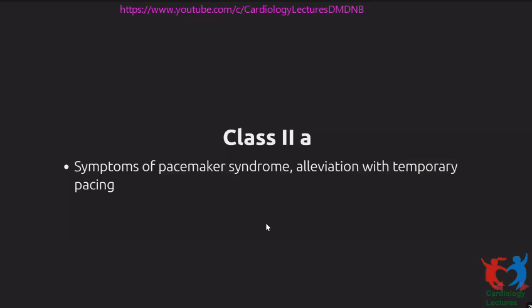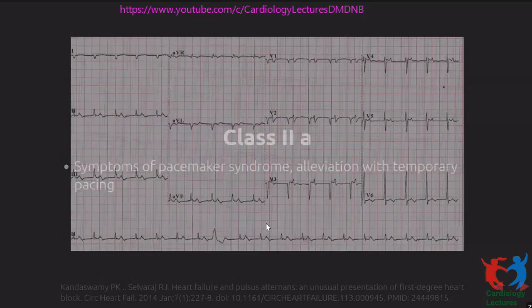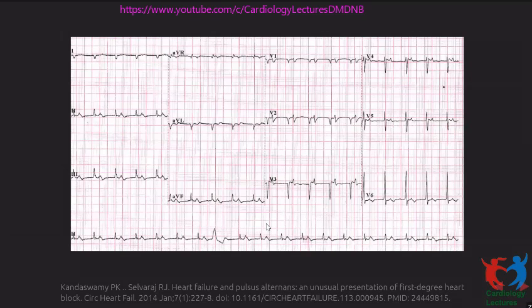So pacemaker syndrome is a condition where you have, so this is one of our patients actually from a few years back, and this ECG looks very bizarre, but what it actually is is sinus tachycardia. This is the P wave, and this whole thing is the PR interval, and there's the QRS, and you can see the next P wave comes almost right on the QRS.